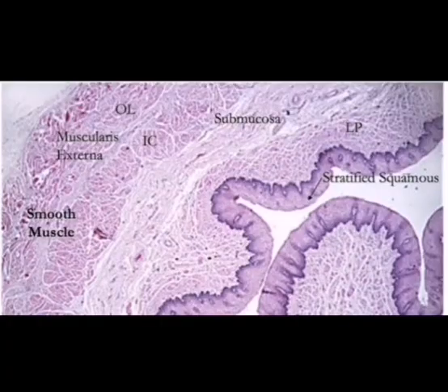So you can see in this picture that we do have an epithelium. This is a picture probably at 10x. So the epithelium here will be stratified squamous non-keratinized epithelium, right? And non-keratinized means that there is no darker layer over this epithelium, right? That is keratin. So no keratin layer, it is non-keratinized and stratified squamous. When we go to a 40x picture, it will be more visible, right? Now you should know that in the esophagus, the epithelium is stratified squamous non-keratinized.